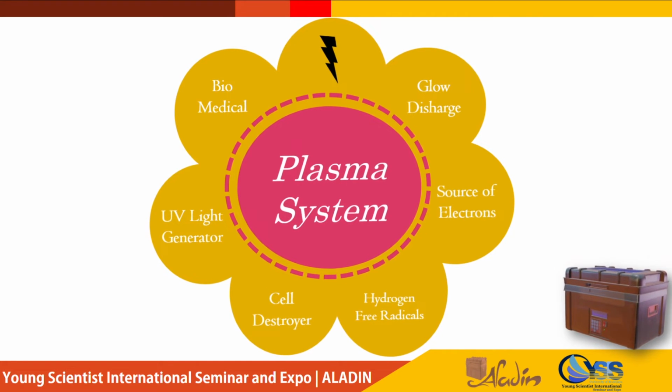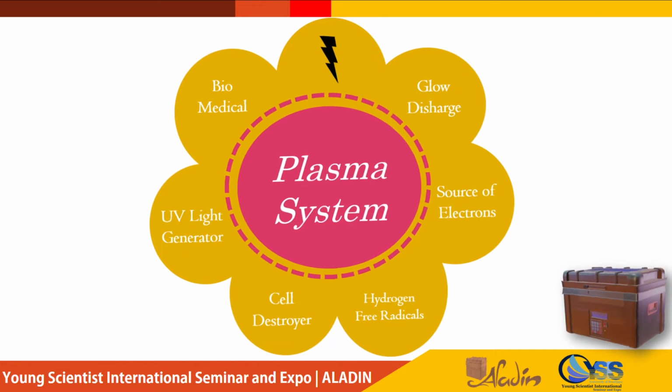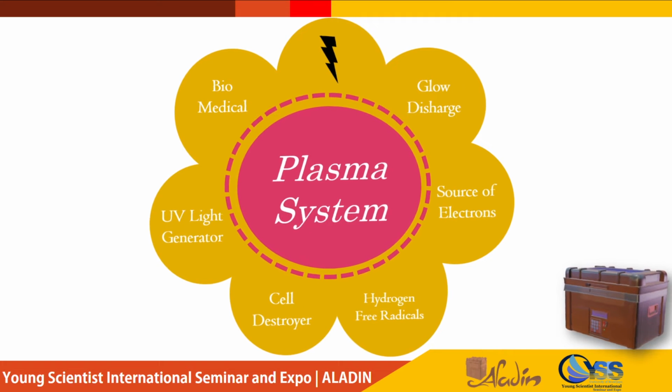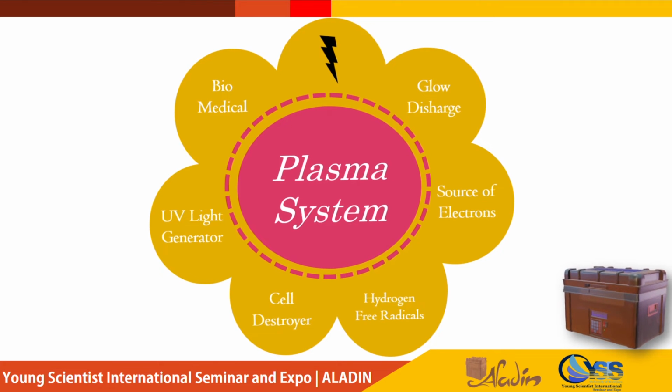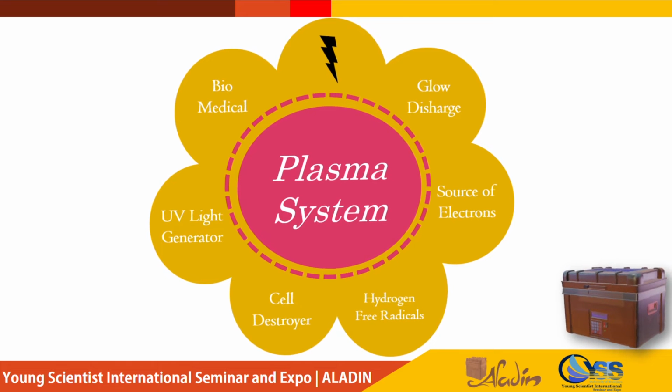Each of these reactive molecules is capable of degrading and changing biopolymers such as deoxyribonucleic acid, usually we call it DNA, and proteins. Ion can interact directly with DNA, causing the polymer bonds to break. Ionization and degradation of important molecules in biological material, such as DNA and enzyme proteins, lead to cell death.